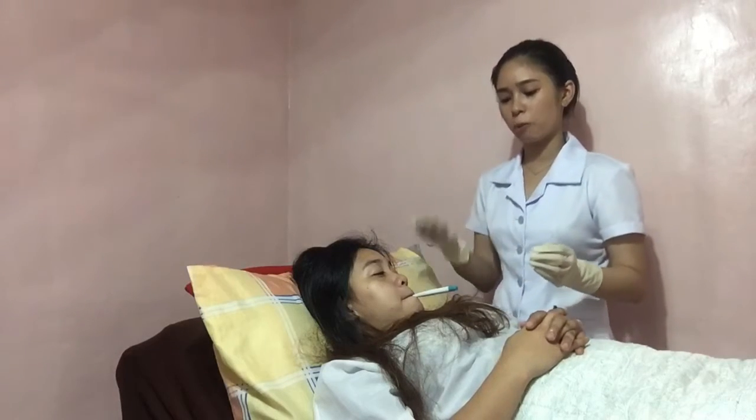And don't forget to turn on the thermometer. So wait for the appropriate amount of time after its placement. So the electronic thermometer indicates the complete reading through light or tone. So Althea, you can open your mouth now. Okay, so you have 35.9 degrees Celsius.